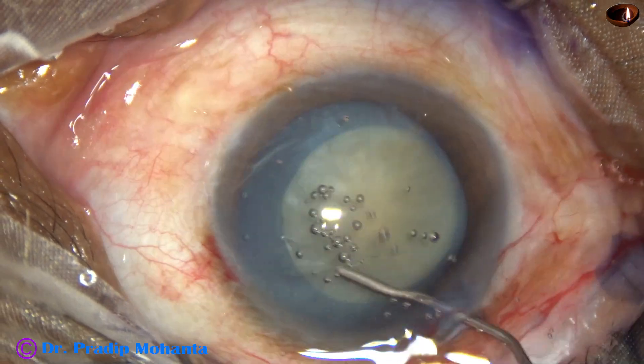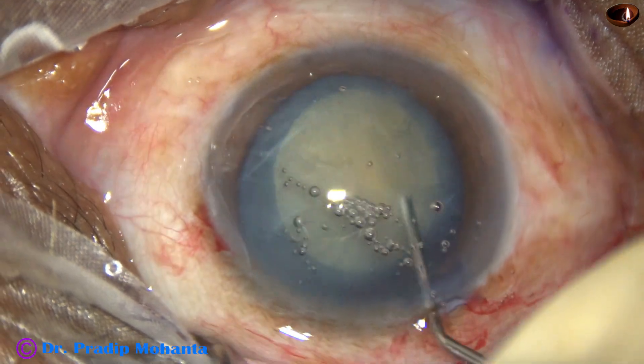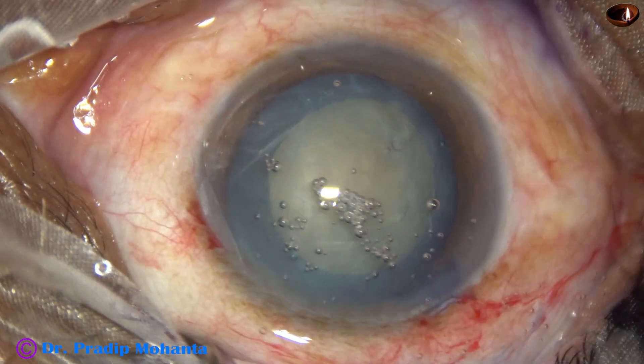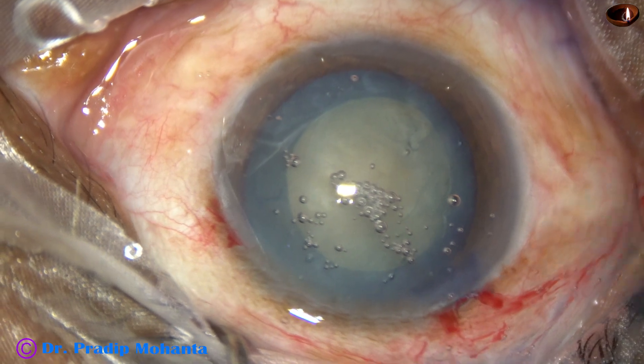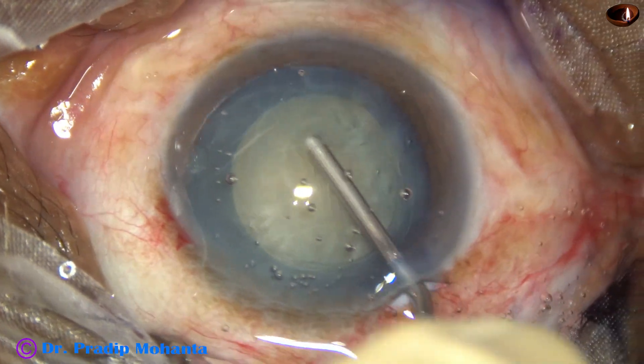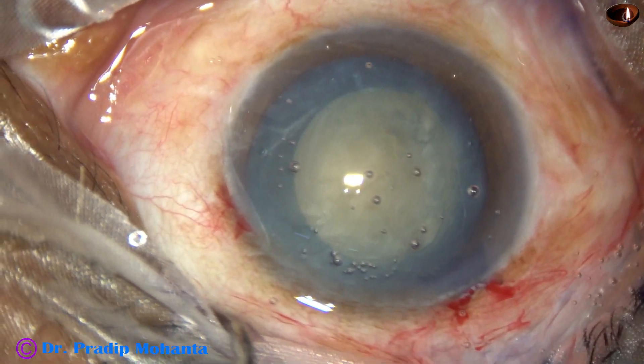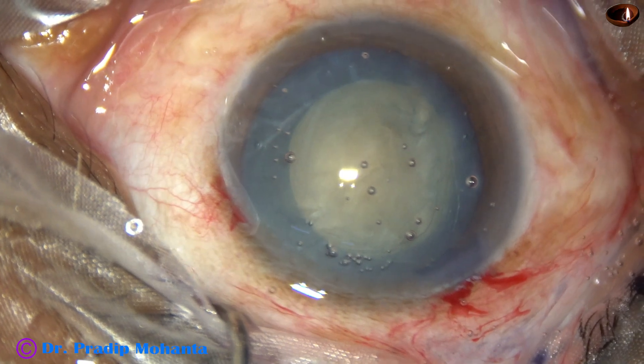Hydrodissection is done. The nucleus is tapped and rotated. In this case, I am going to do the divide and conquer technique of phacoemulsification.